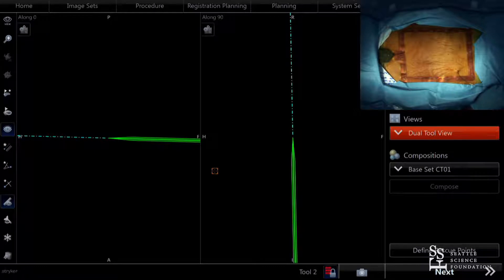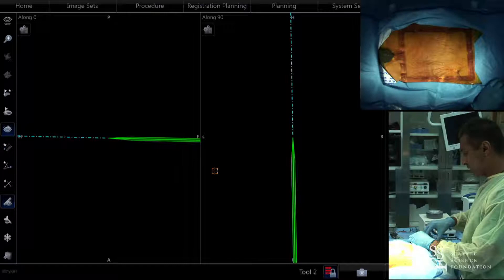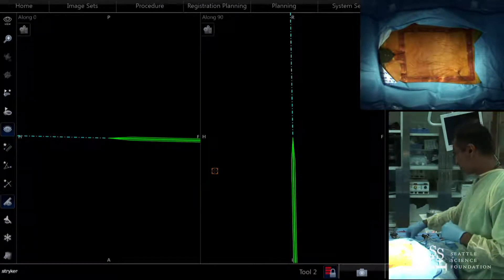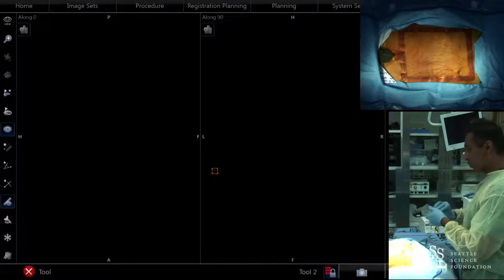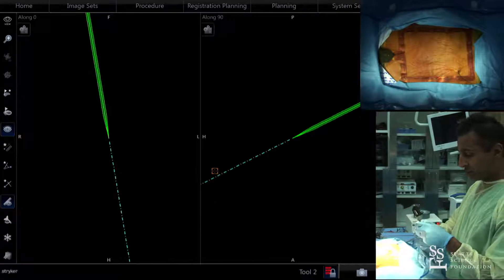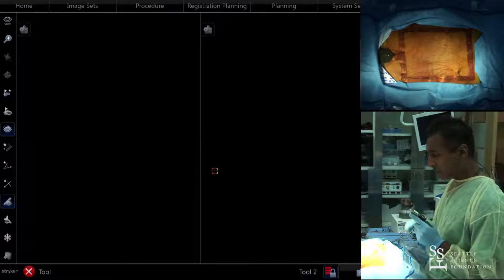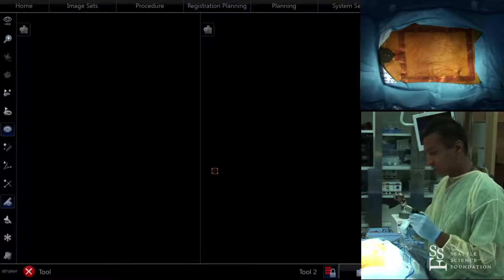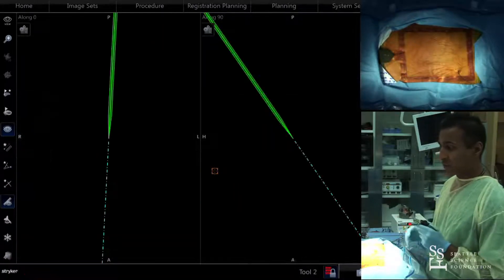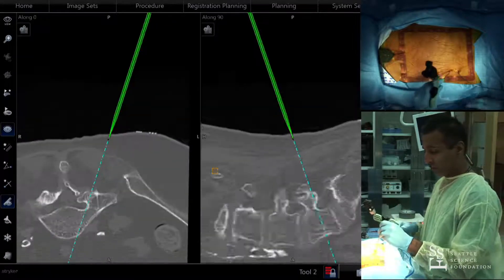This cadaver had a CT scan done. Back home I generally use this navigation with the Ziem, which goes back and forth between 2D and 3D fluoroscopy. You can also use it with the O-arm, Brainlab, et cetera. I prefer the spine mask because it avoids having to place pins in the pelvis, and it functions very nicely with the Ziem.